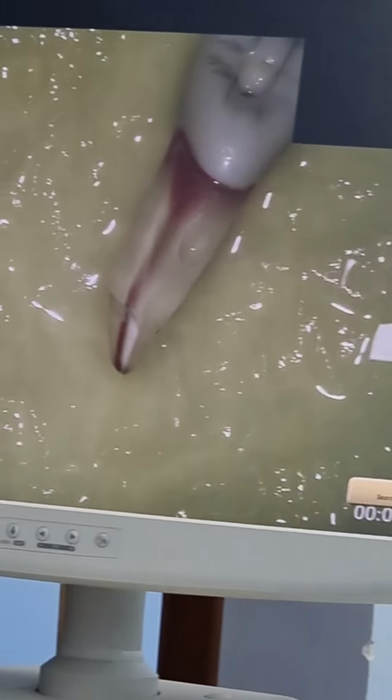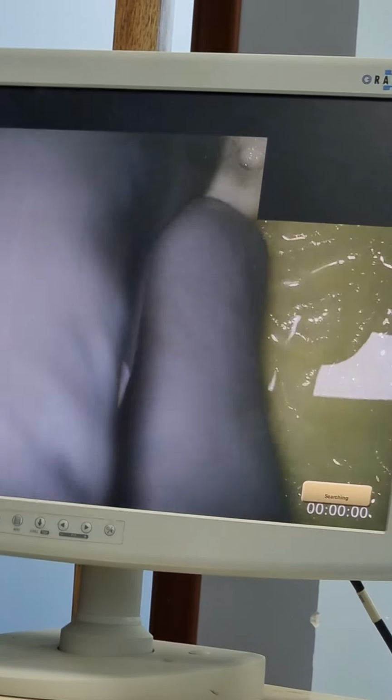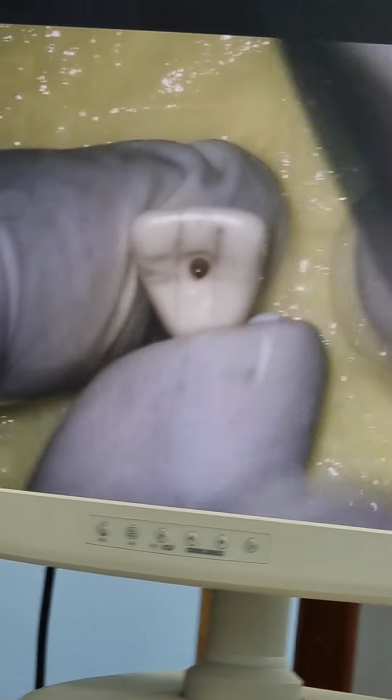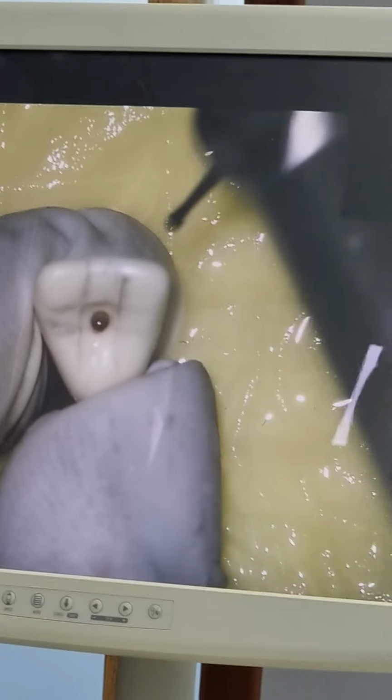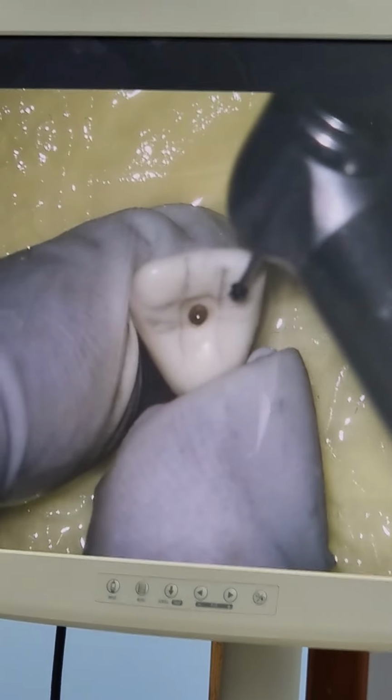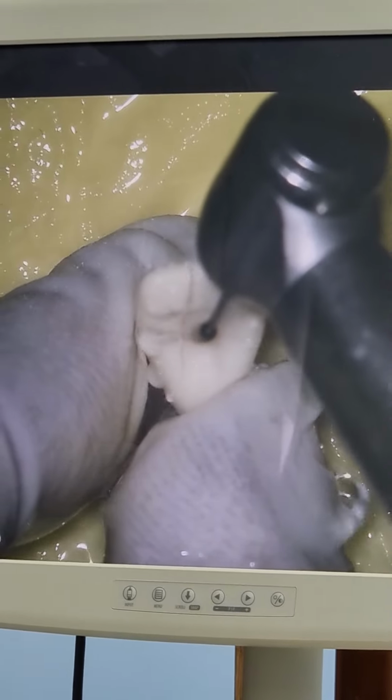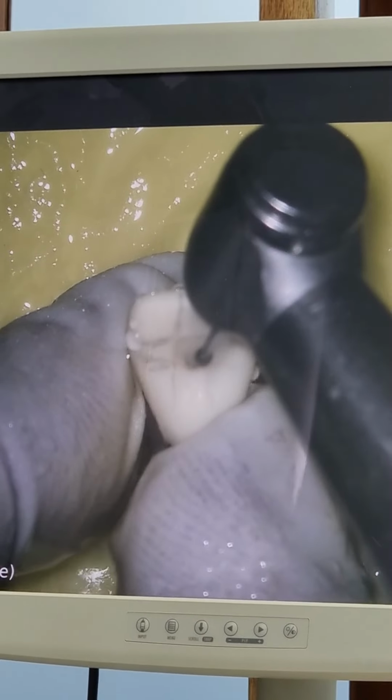Now I'll show you here on the tooth. So now we're going to start with the de-roofing. I have exposed the pulp chamber. That black opening here is the roof of the pulp chamber which is exposed. What I'm going to do is, maintaining my outline form, with the same round burr, I will go inside, engage the undercut, and move the burr inside out.